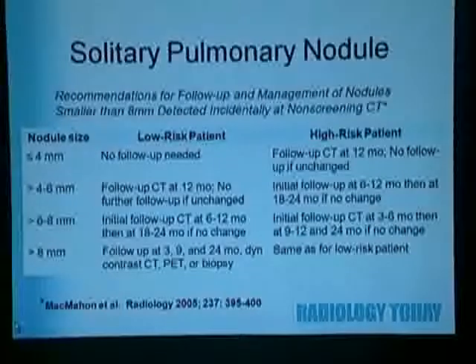And the Fleischner Society in Radiology published their results, and these are recommendations for follow-up and management of nodules smaller than 8 millimeters, which are incidentally detected on non-screening CT. And I can tell you, our practice tries to follow these. It's important because it provides a nice standard framework so that we're all on the same page about what we're doing with this pulmonary nodule.